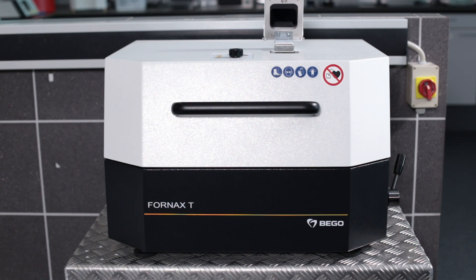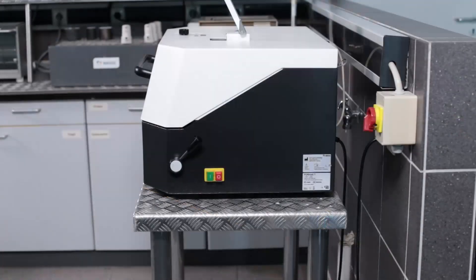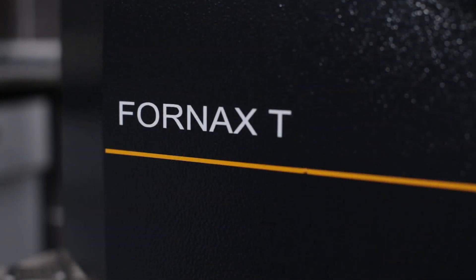The new Fornax T distinguishes itself from other casting devices on the market by a number of special features that make it easier for the dental technician to work. It is equally well suited for precious metal and non-precious alloys up to a casting temperature of approximately 1550 degrees Celsius.